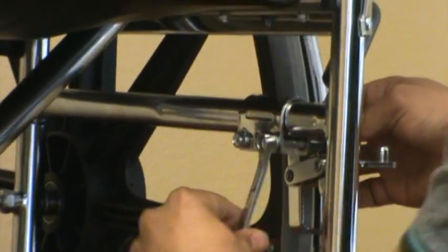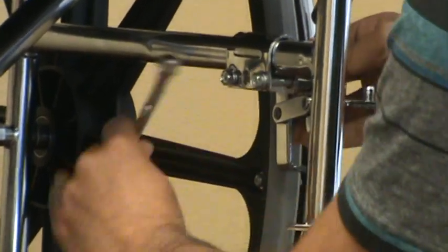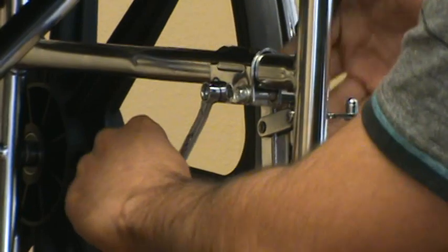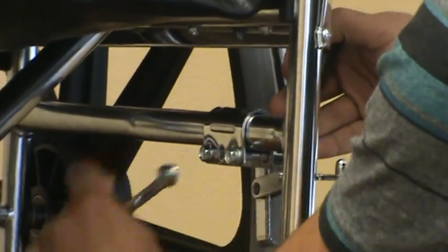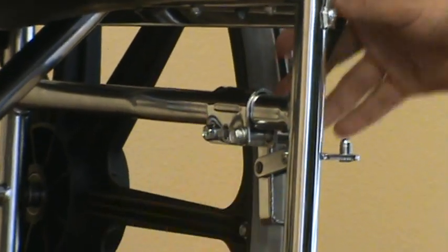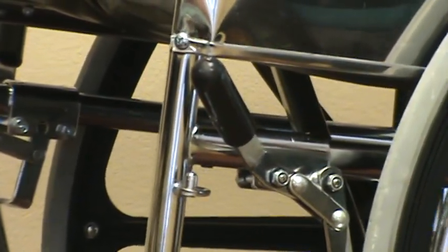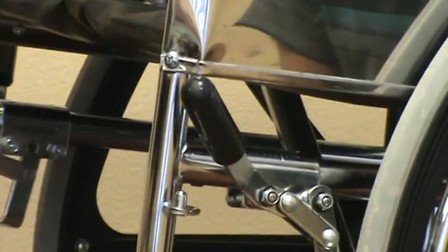To figure out which wheel lock you need, we did a prior video showing how to choose the correct wheel lock for your standard manual wheelchair. After you tighten it, try it — make sure it's not too hard to push and that it holds the tire tight. It's as easy as that.